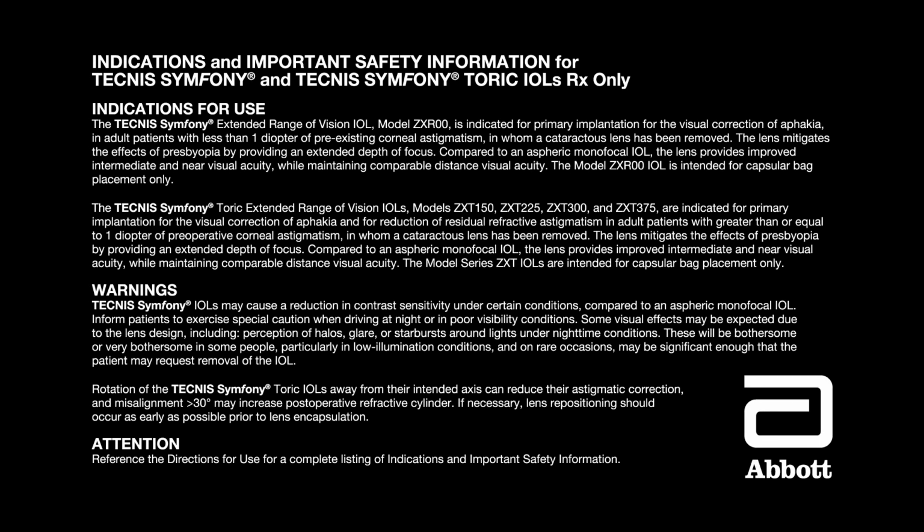Indications and important safety information for Tecnis Symfony and Tecnis Symfony Toric IOLs. RX only. Indications for use. The Tecnis Symfony IOL model ZXR00 is indicated for primary implantation for the visual correction of aphakia in adult patients with less than 1 diopter of pre-existing corneal astigmatism in whom a cataractous lens has been removed. The lens mitigates the effects of presbyopia by providing an extended depth of focus. Compared to an aspheric monofocal IOL, the lens provides improved intermediate and near visual acuity while maintaining comparable distance visual acuity. The model ZXR00 IOL is intended for capsular bag placement only.